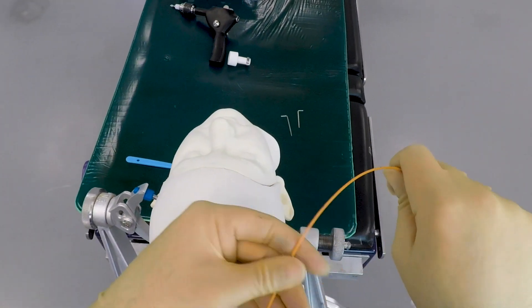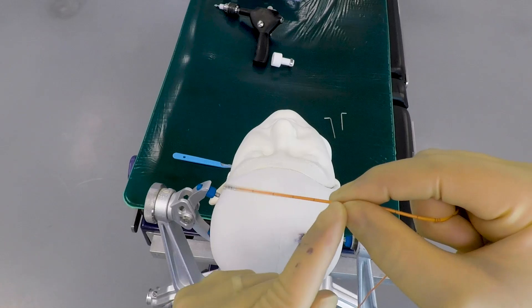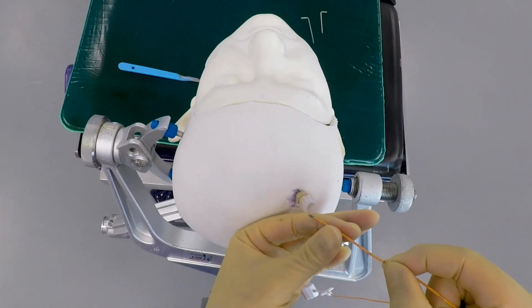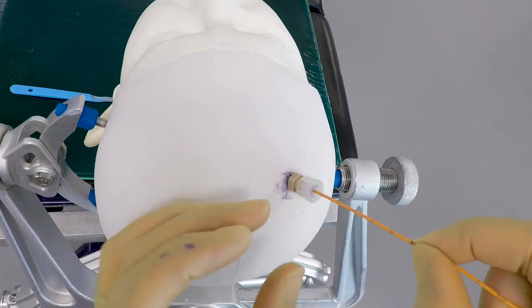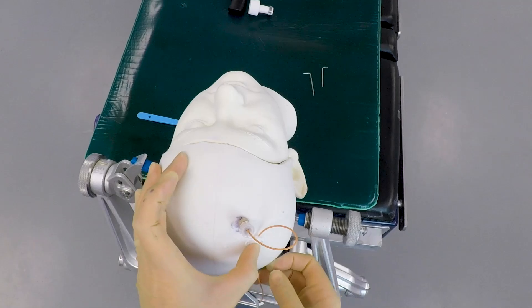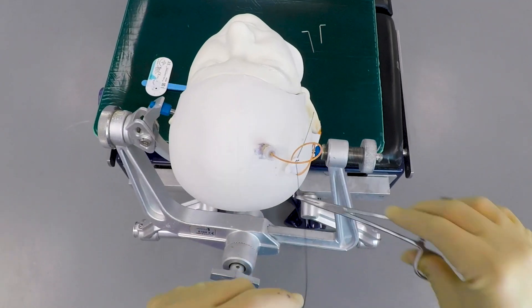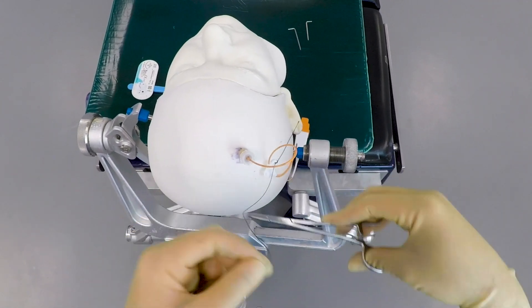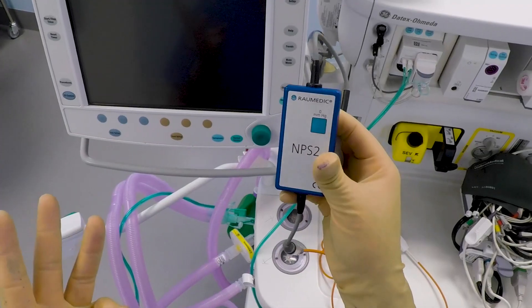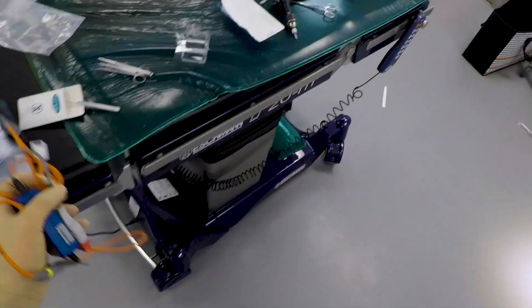Then the bolt is screwed into place. After that, we're ready to pass the sensor into the brain — it doesn't need to go in very far, usually only about 20mm or so. A plastic locking nut keeps the sensor in place and doesn't let it slide in and out. The wire might be stitched down to the scalp to prevent it from being pulled out. The sensor is then connected up to a monitor and the pressure reading will be used to guide your treatment.